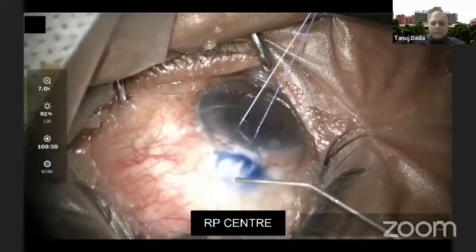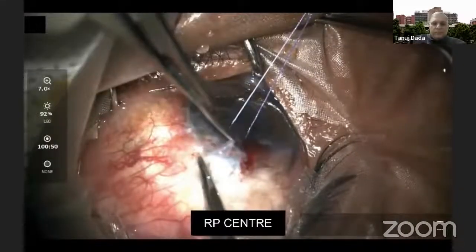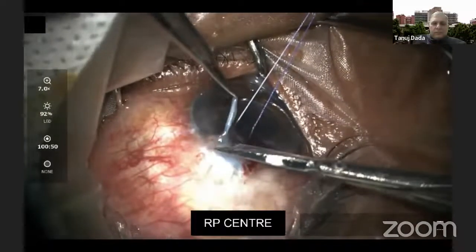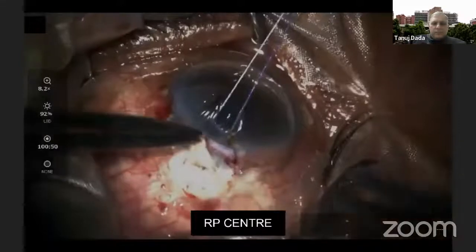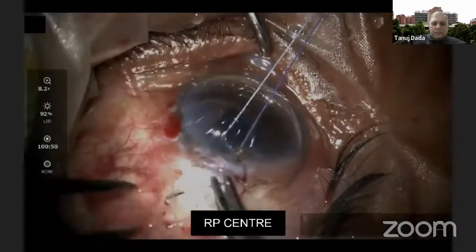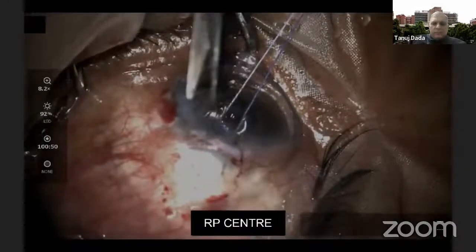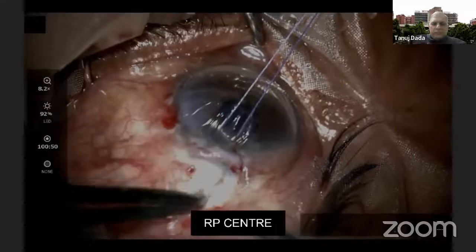After local debridement of the unhealthy conjunctiva over the bleb, the surrounding conjunctiva was undermined to create a conjunctival Tenon flap. Intraoperatively, the scleral flap was found to be thin and necrotic. A 10-0 nylon suture was used to close the existing flap, but due to tissue friability, the suture cheese-wired.